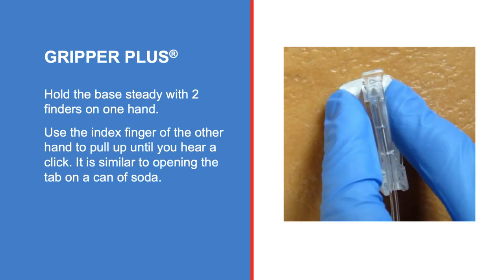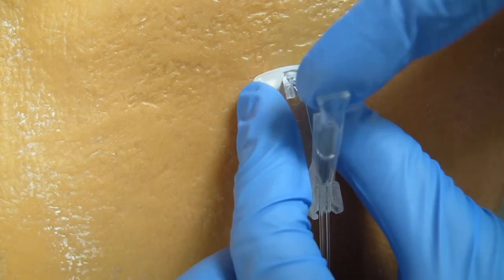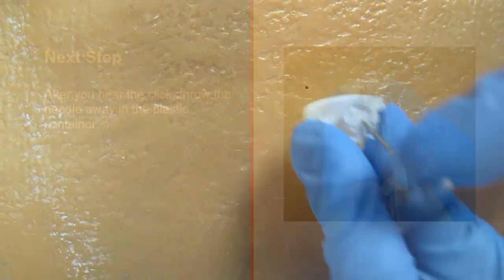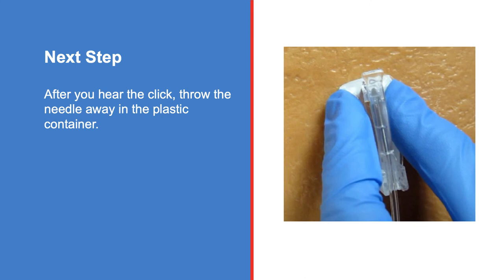For the gripper plus, hold the base steady with two fingers of one hand. Use the index finger of the other hand to pull up until you hear a click. It is similar to opening the tab on a can of soda. After you hear the click, throw the needle away in the plastic container.